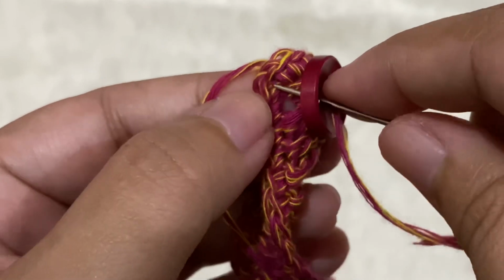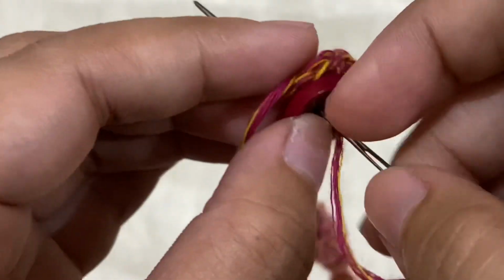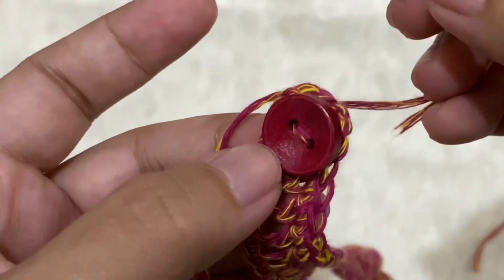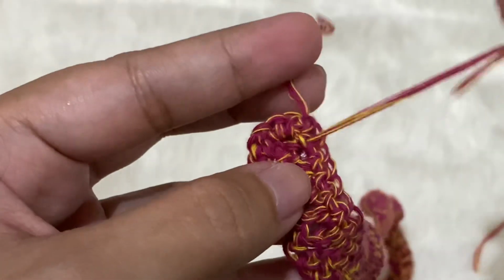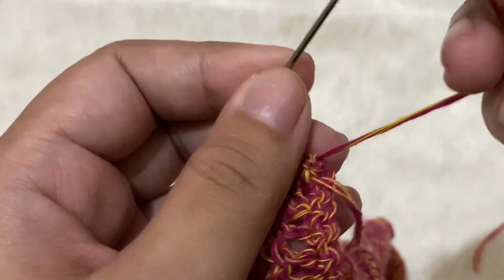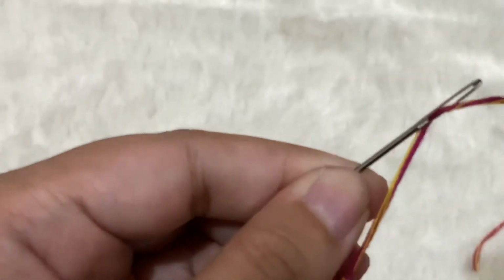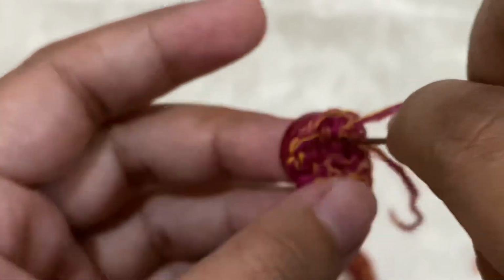So you don't really have to do the same way that I'm doing right now. I mean, if you have a different sewing technique, that's okay too. This is just my way. So this is just one tail right here, and then what I will be doing next is remove that yarn from the needle. Okay, and insert the other tail right there, that tail from the beginning of our foundation chain. Because right now I'm just seeing that they're both on that side, and I want them to be on the opposite side of the button, and I also want to give another round of thread or yarn into those buttonholes right there. So one more time.